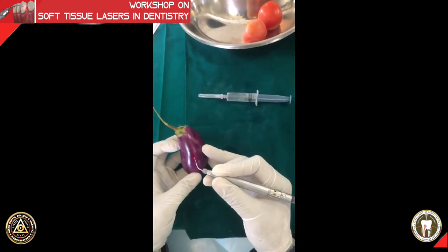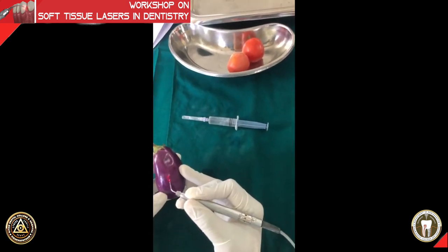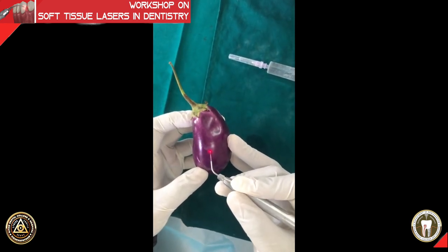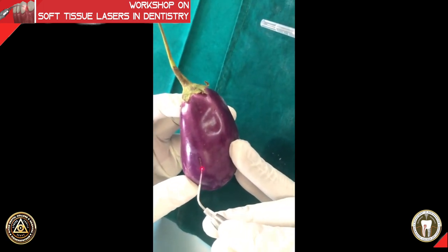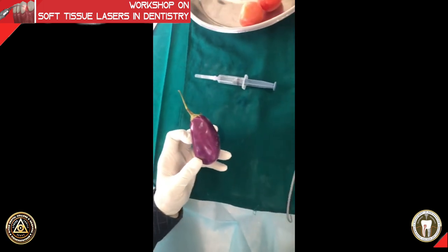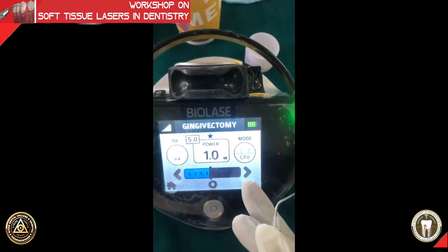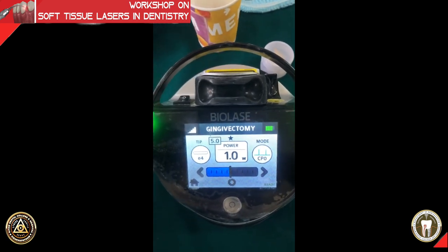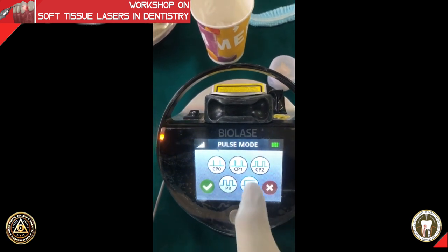Next we are going to start with the incision procedure. Sir is demonstrating in continuous wave mode at one watt. We are showing this so you can see the difference between continuous wave mode and pulsed mode later, and observe how different the cutting is when it happens.